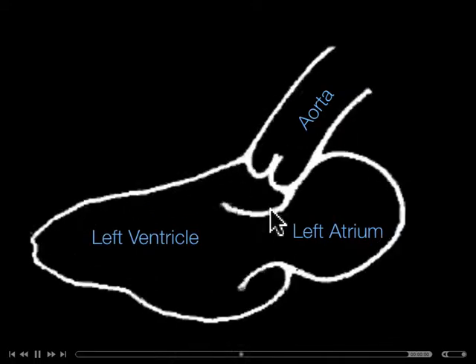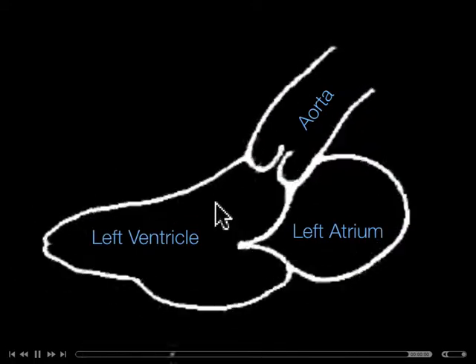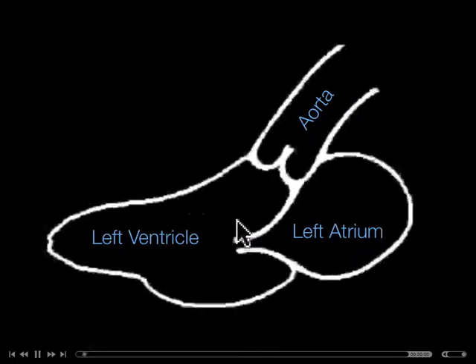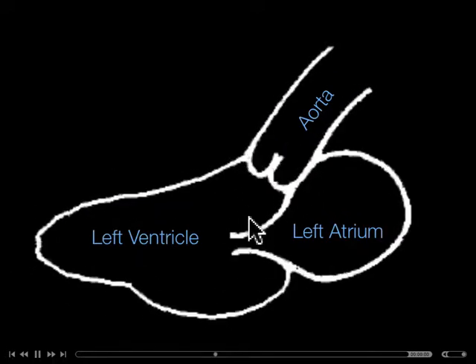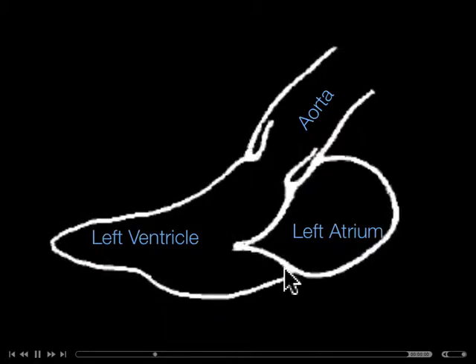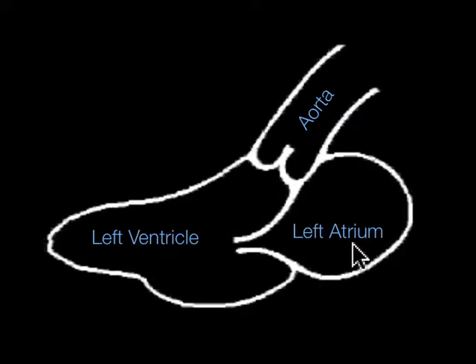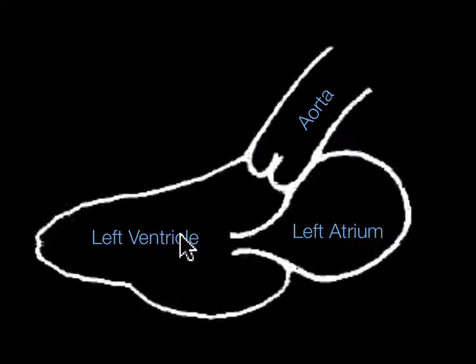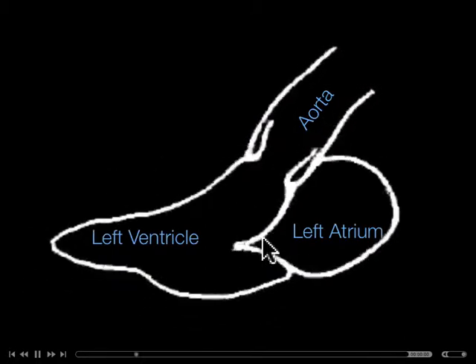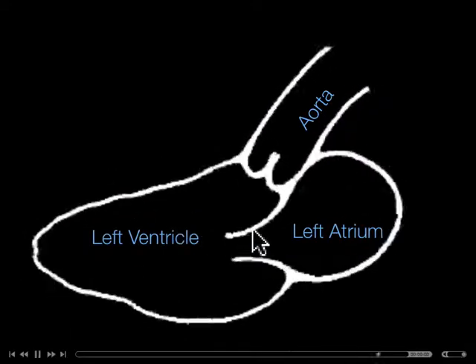And you can make out this mitral valve. It's a bicuspid valve. We see the anterior leaflet right here. We can see as it makes its way up towards the interventricular septum, which is right here. And ideally, you should see that anterior septal leaflet of the mitral valve come up and smack that interventricular septum. And here's that posterior leaflet down here. So during diastole, when the heart is sucking the blood out of that left atrium into the left ventricle, as it expands out like that, a good functioning left ventricle will get that mitral valve to open up nice and wide.